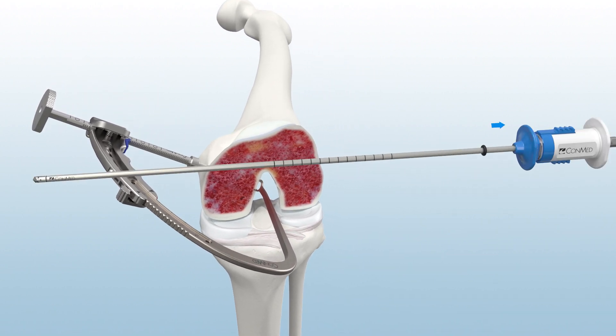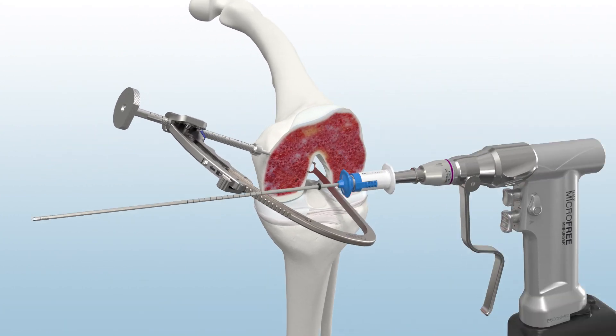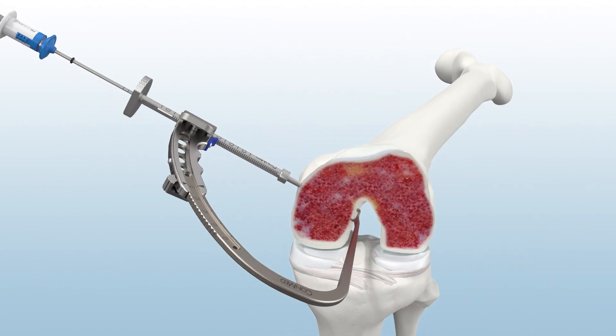Next, prepare to drill using the Infinity Retro Reamer. Connect to the Hall MicroFree Mini-Driver using an AO Trinkle attachment and insert down the guide sleeve. With the handpiece in forward, drill through the femur until the tip is exposed within the joint.